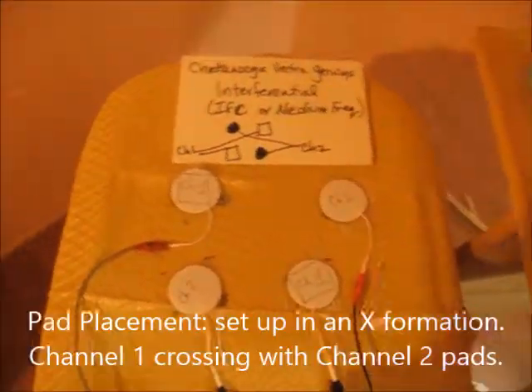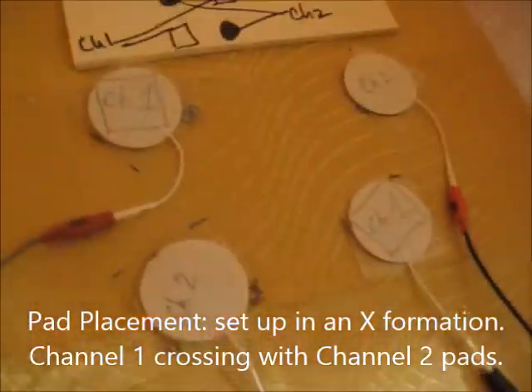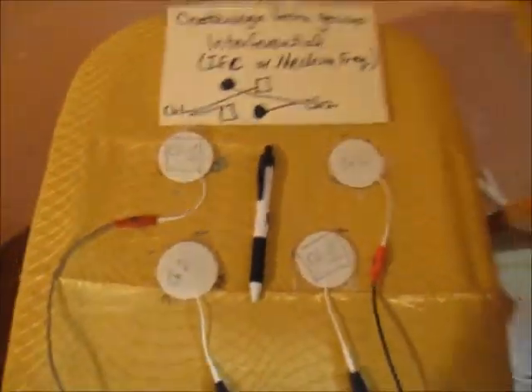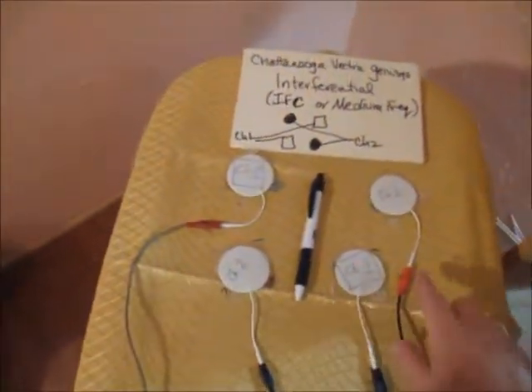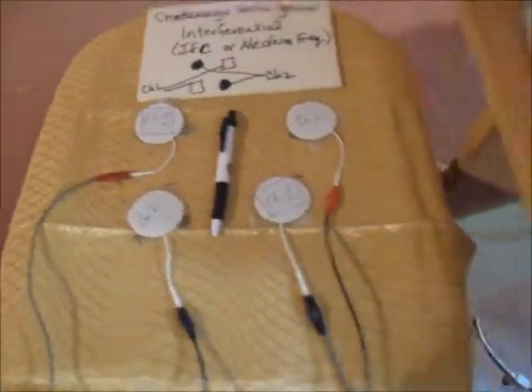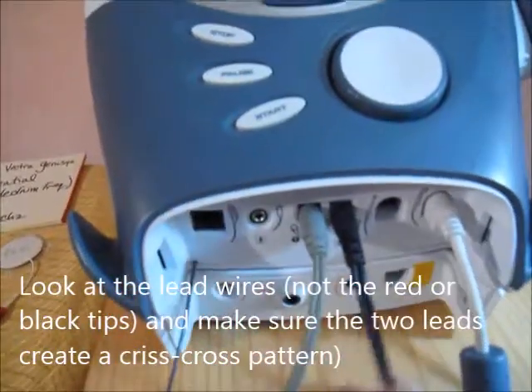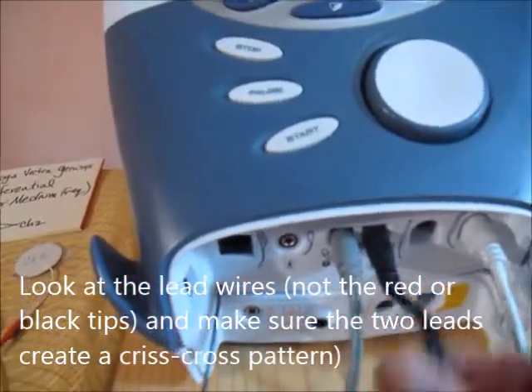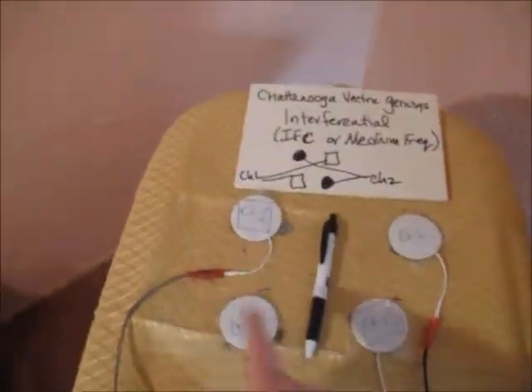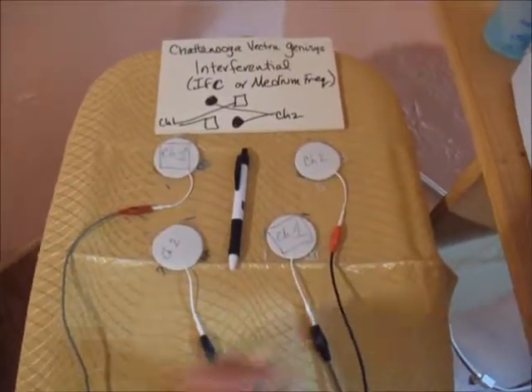Pad placement is the same as it ever is. I'm going to pretend this pen is the spine. You don't have to worry about red and black anymore — the gray lead goes to channel one and the black lead comes out of channel two. The gray and gray go to channel one, and the black and black go to channel two.